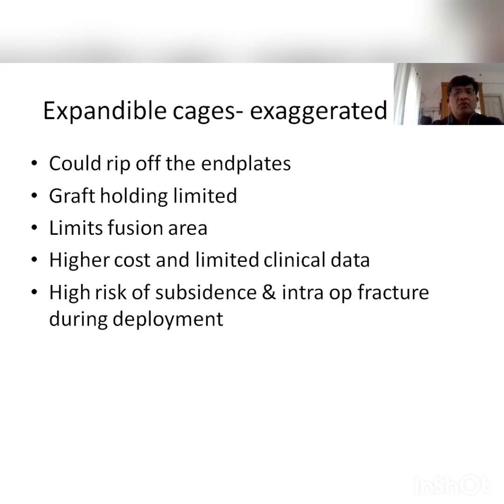So what I want to put across with this talk is that while we use such devices, we need to take into account various factors like the age of the patient and the bone quality, and we need to carefully judge the possible risks and the benefits involved with the use of such expensive devices before you actually employ them.